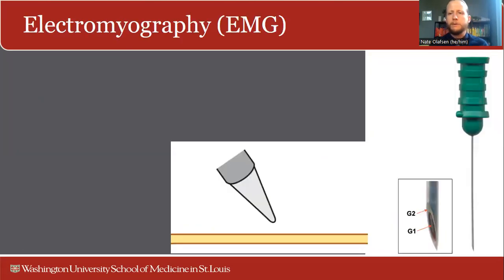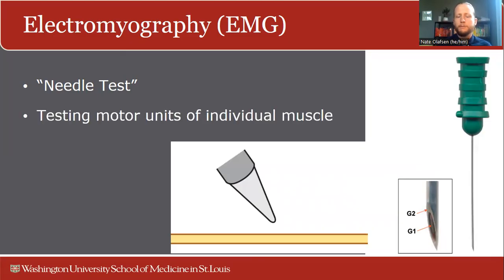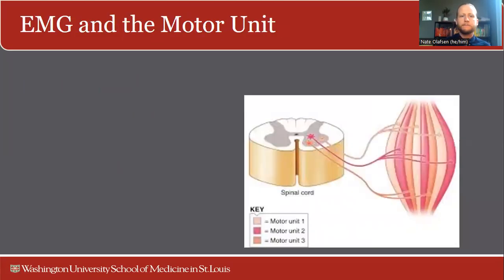Let's dive more now into EMG, or electromyography. In this, your patients may call this the needle test, okay? What you're doing is testing motor units in an individual muscle to see how they're working. We assess the muscles at rest as well as when the muscle is activated.